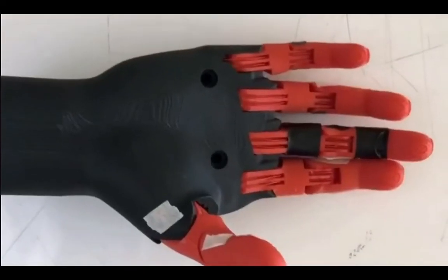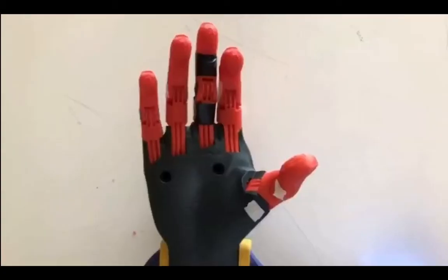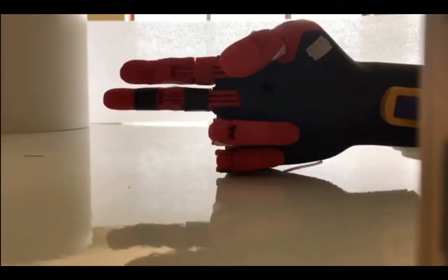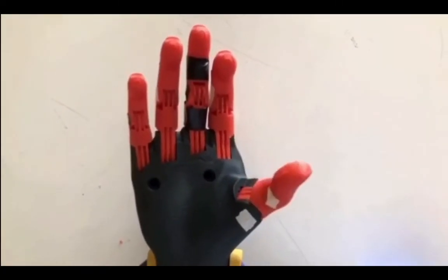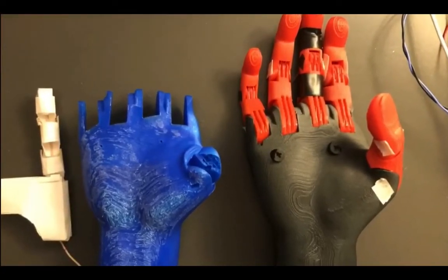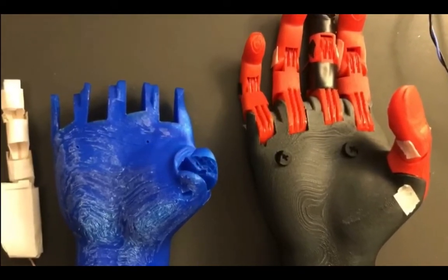Before we started making our own designs for prosthetics, we decided it would be best to do our research first. So we went online, downloaded some free files for prosthetic hands, and printed them to really understand how prosthetic hands worked and the type of ergonomics we would need to make them work. Speaking of ergonomics, we realized how important it was to have a high quality print, or else the hand would not be able to hold things correctly.